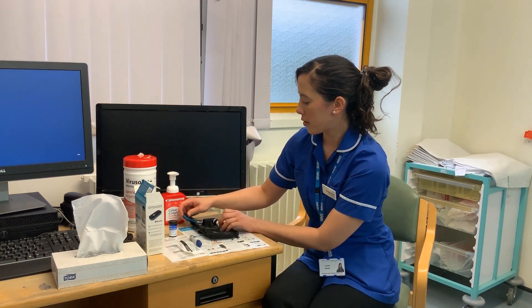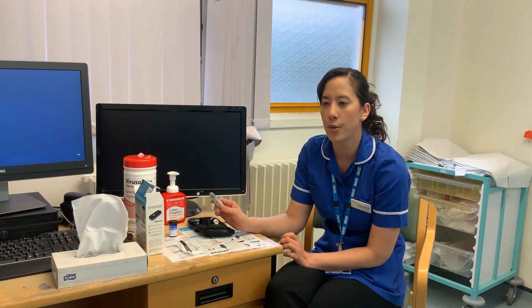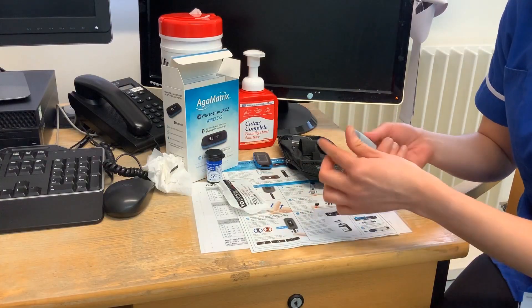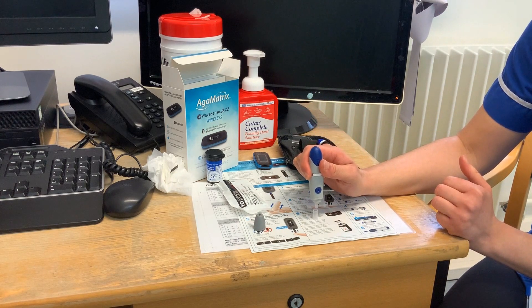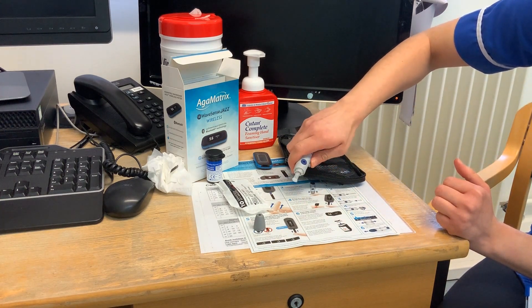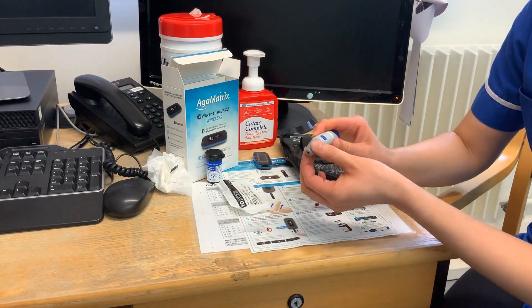Next you need to change your needle. These needles blunt straight away, so you'll need a new needle for every test. To do that, grab the cap you had earlier, pop it on a hard surface, unscrew the top, click it in, and then eject it using the part on the side. Pop your cap back on and then you're ready for your next test.